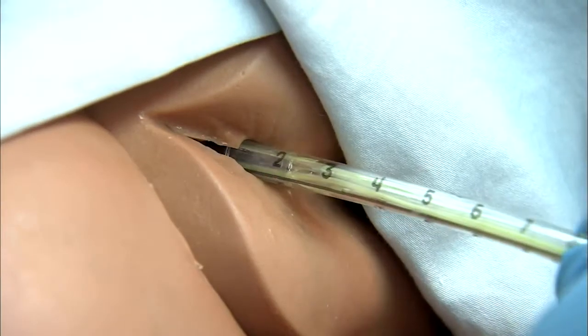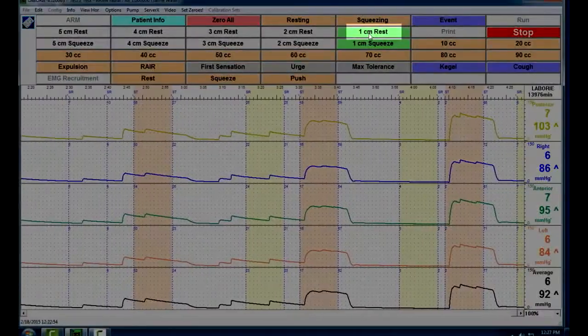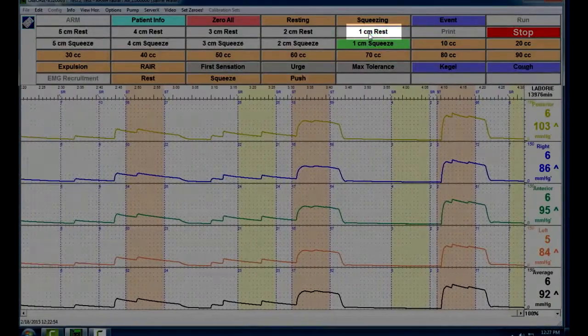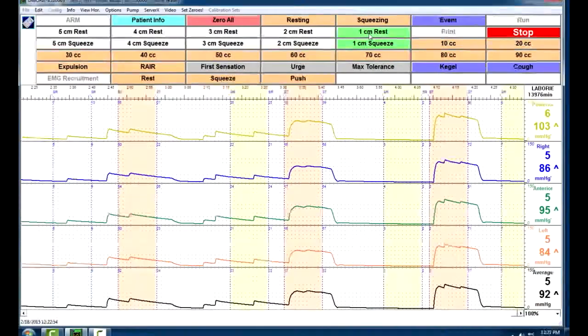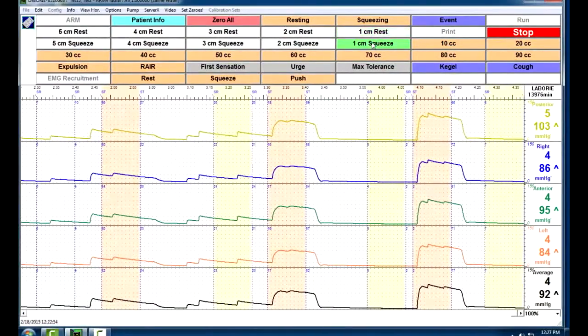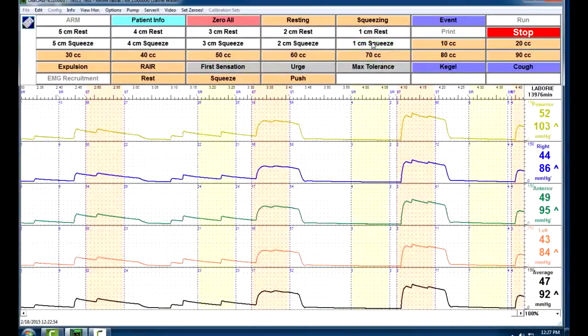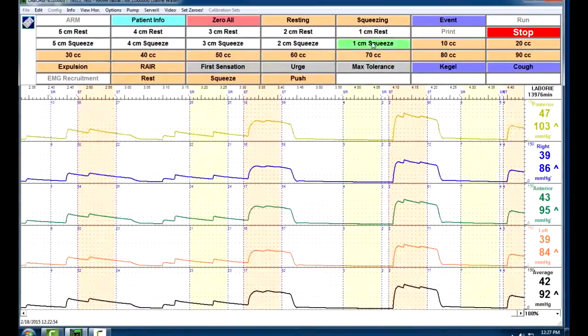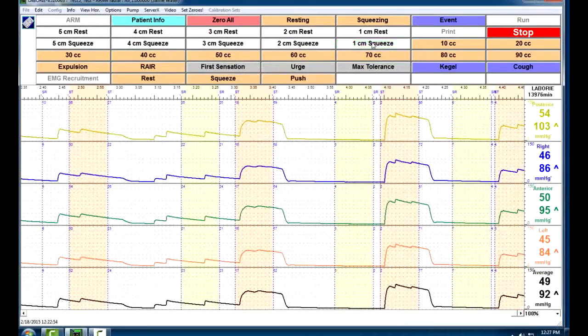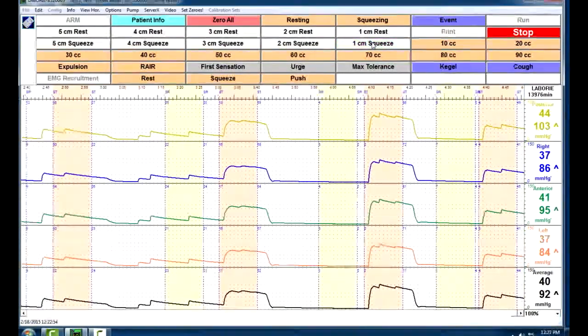One more time, we're going to move it to the 1 centimeter mark, have them relax and just rest there, resting quietly, doing real good, almost done. You can tell them this is the hard part. And again, we're going to ask them to squeeze now. Go ahead and give me a big tight squeeze. That's it. Keep going. Hold it. We're almost done. Good. And relax. And now we're done with that segment.